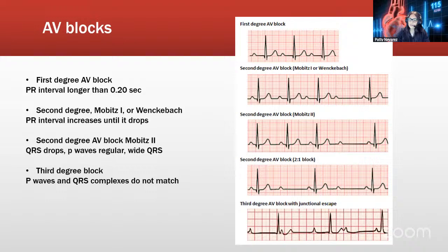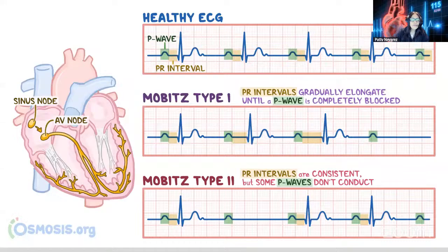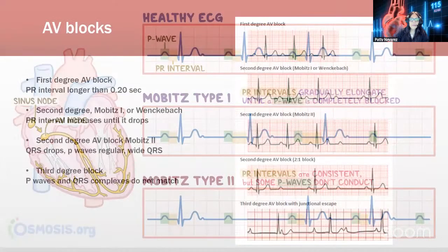Okay, let's take a look at, let me see here. Okay, here.